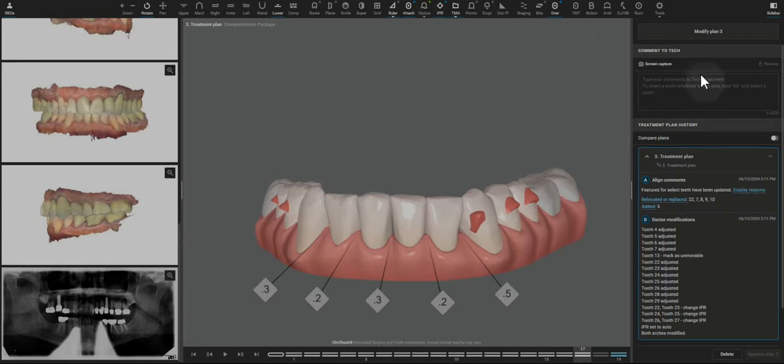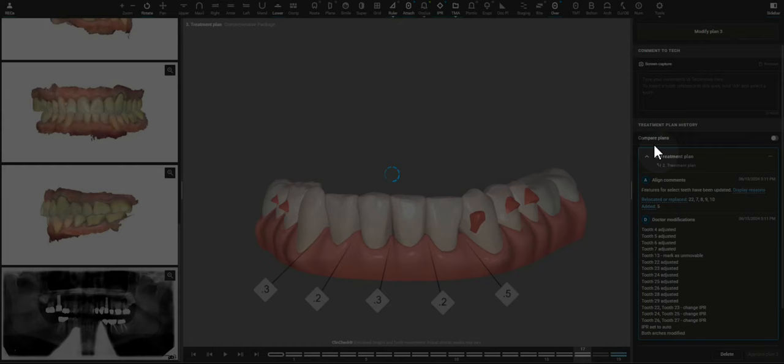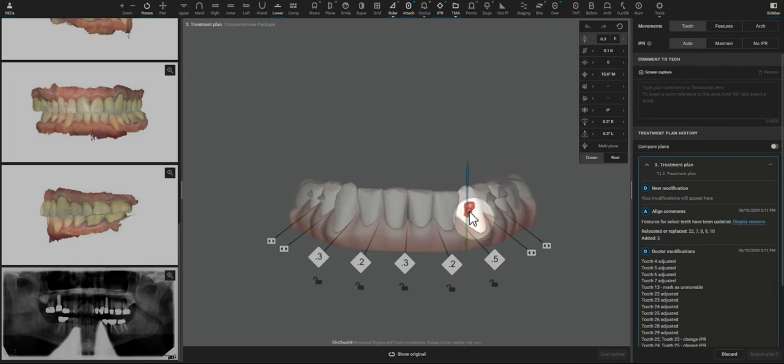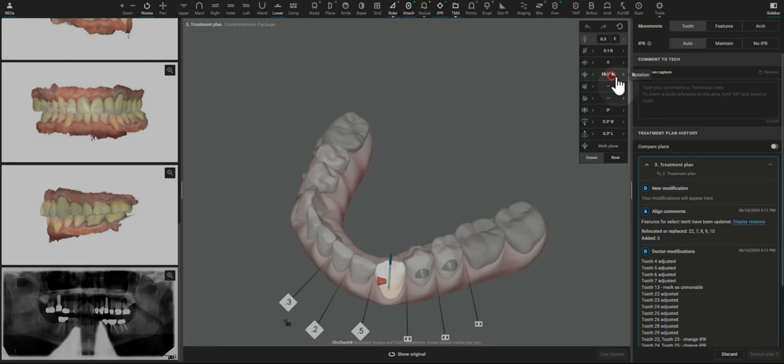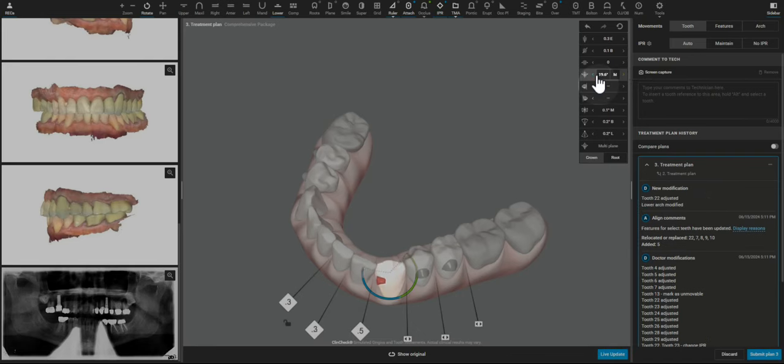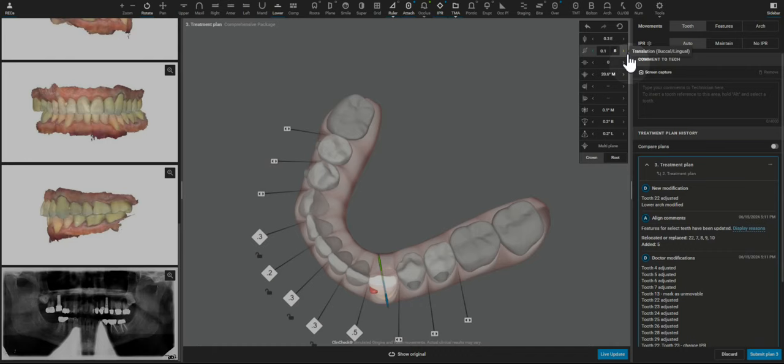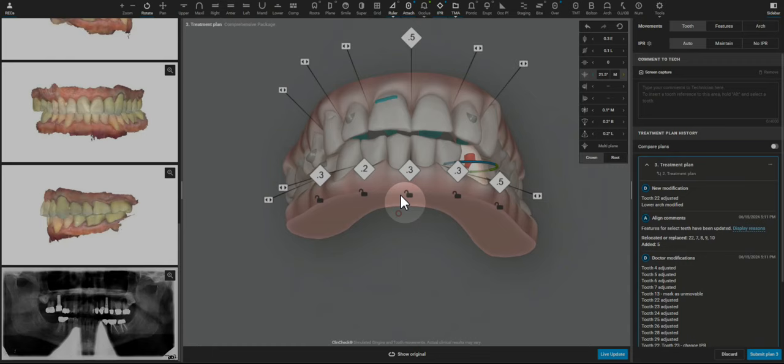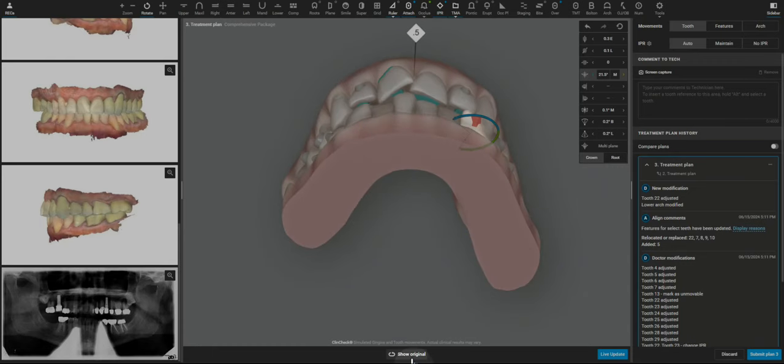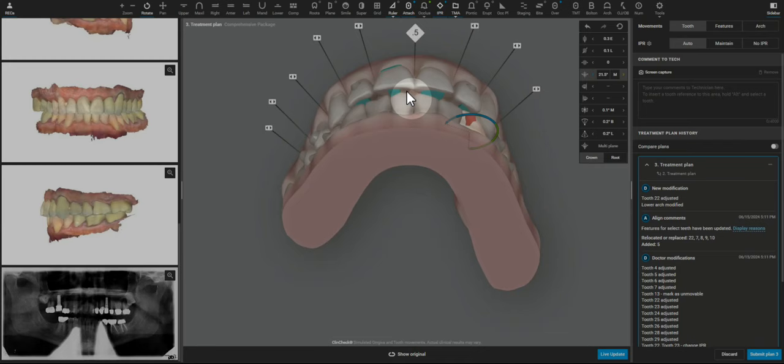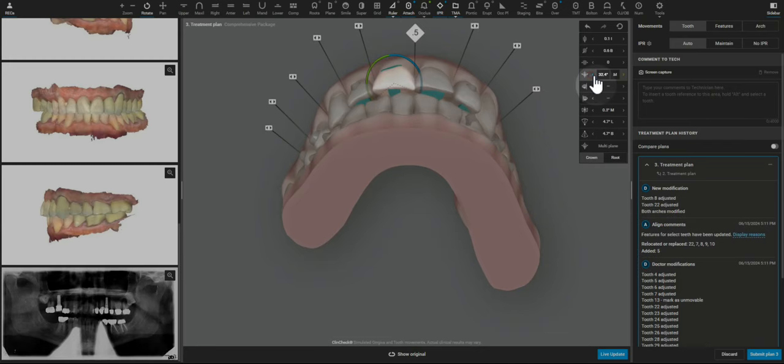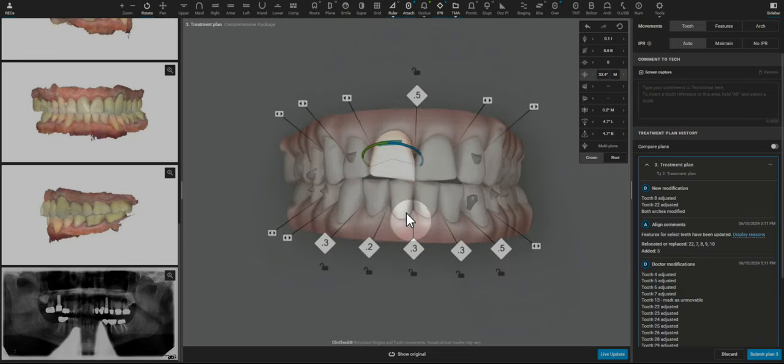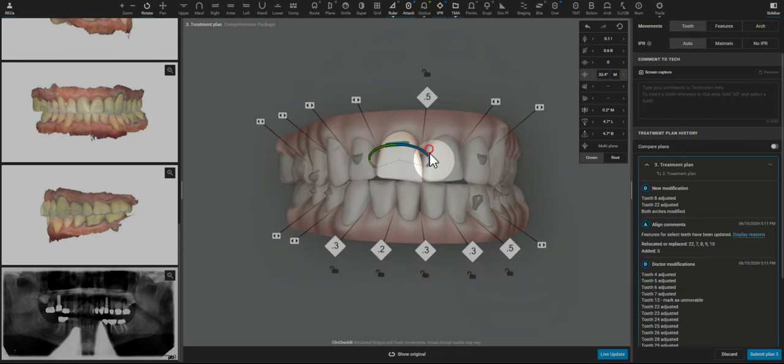And for my secret sauce, I'm going to over-treat the chief concerns or the biggest rotations that the patient would visually notice. Rotation is a relatively easy movement to do, but I do find that the PDL and bone can work against us a bit. So I'm going to add a few more degrees of rotation here and the upper incisor was mesial out to start off. On the ClinCheck, I'm going to make it just a little bit mesial in. That way we can really make sure that we have that push because I hate falling short of the goal.